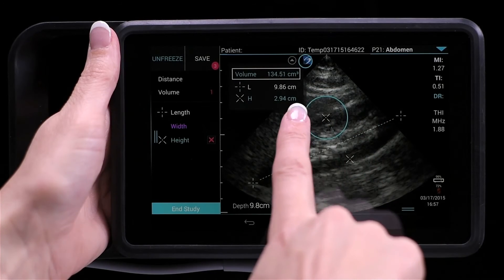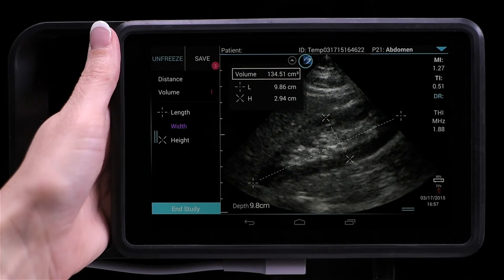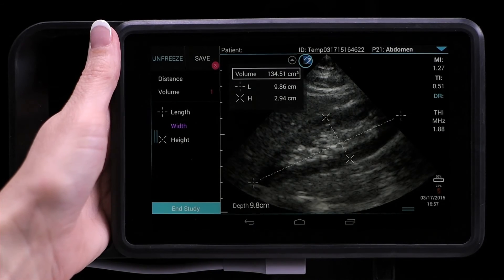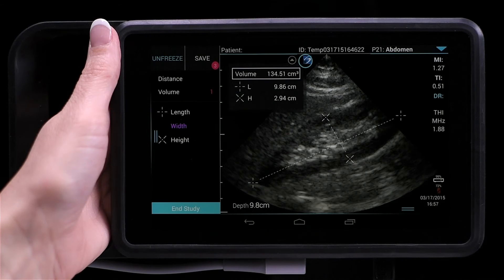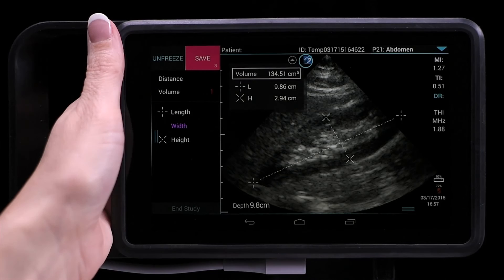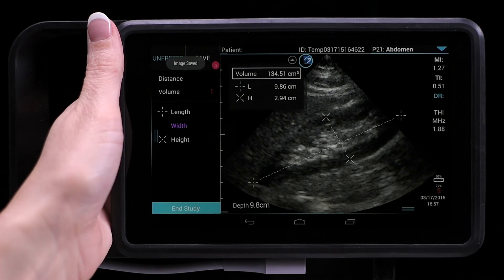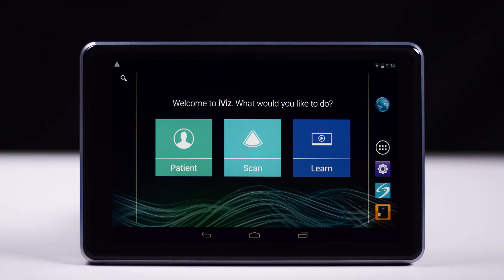Be aware that general measurements appear on screen only and are not in a specific report page. Because of this, we recommend that you save the image with the measurements before ending the study. For more information about measurements and calculations, refer to the iViz User Guide.